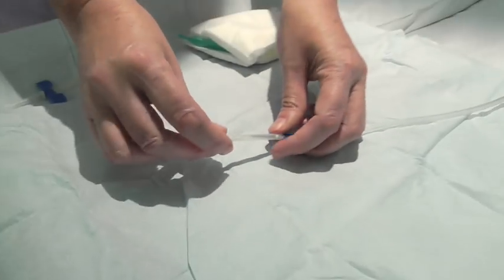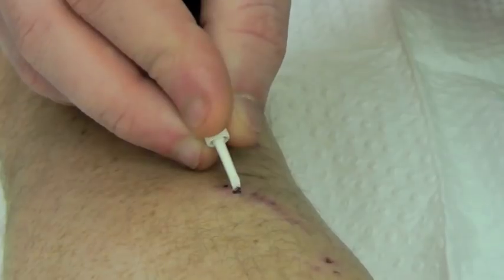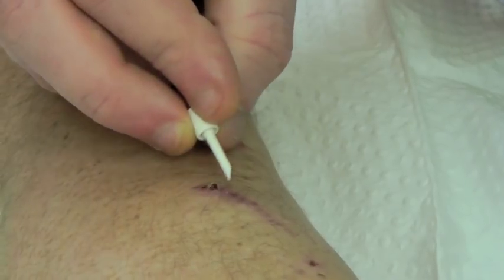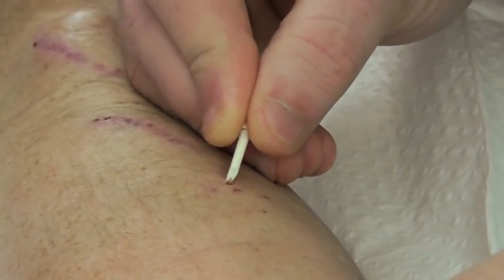This is a buttonhole needle. It has a scab picker on the end of the needle which fits onto the needle cover to make it a bit easier to hold. This patient is picking the scabs off his fistula. You must make sure that you get all of the scab off so you don't push any part of the scab into the buttonhole tract.